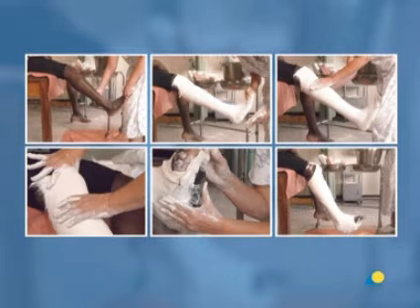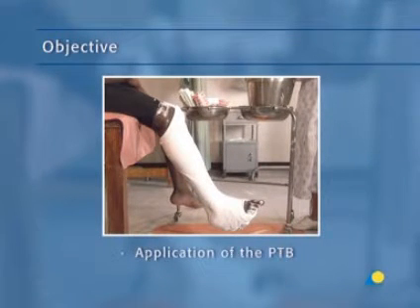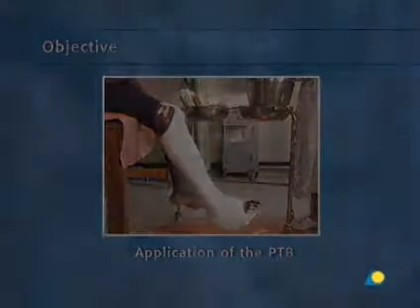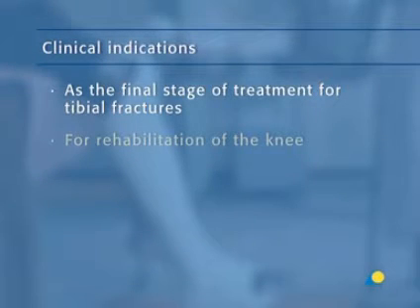In this presentation, the application of the PTB will be demonstrated. The objective of the exercise is to show the application of the PTB, a plaster cast that will stabilize the fracture while stimulating bone growth. The PTB is indicated as the final stage of treatment for tibial fractures and for rehabilitation of the knee.